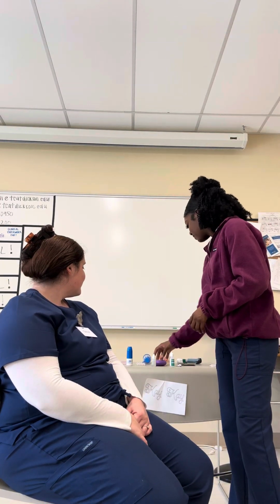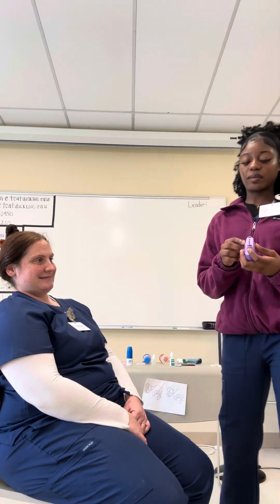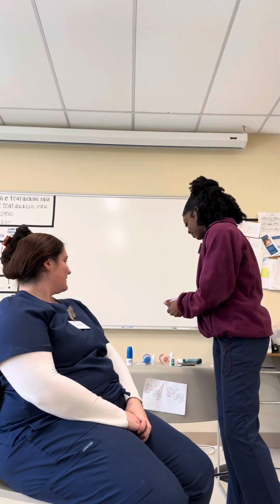And then for the dry powder, first, it's kind of the same as the meter dose. You're going to open it, and then you're going to load it up, push it back, and you'll see a number on here. You have the patient inhale the powder, and then you would give them some water to swish around in their mouth. And that is it.